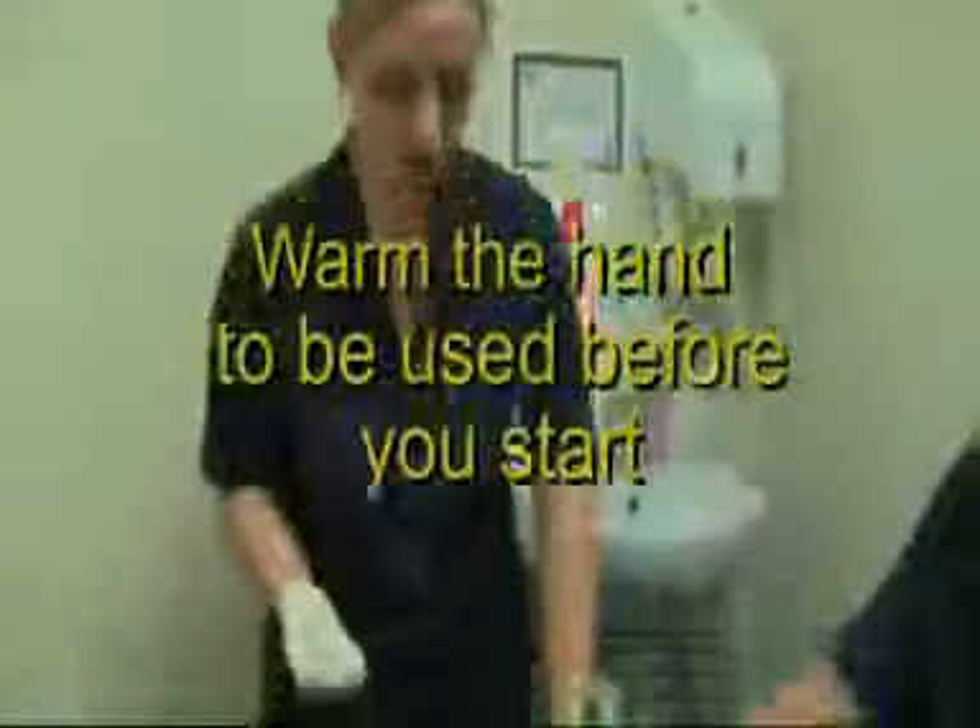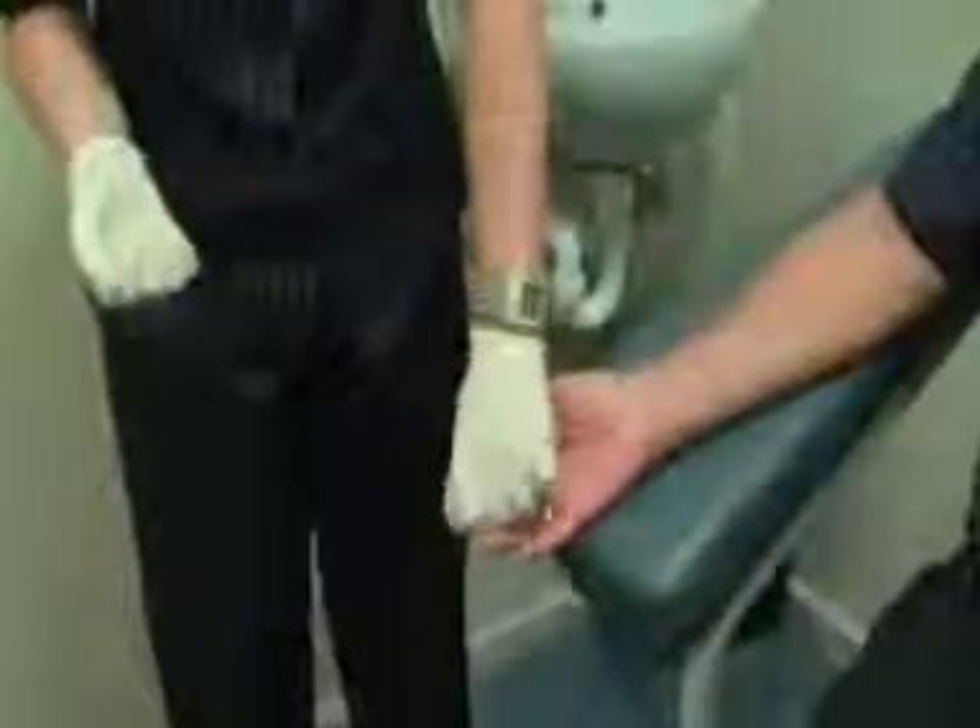The first thing you need is to check and make sure the patient's hands are warm. If they're not warm, get your patient to run them under warm water until they do become warm.